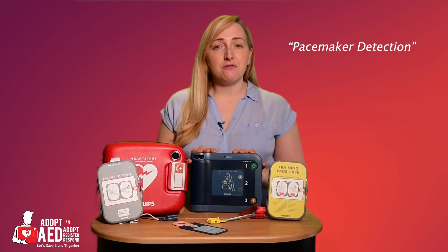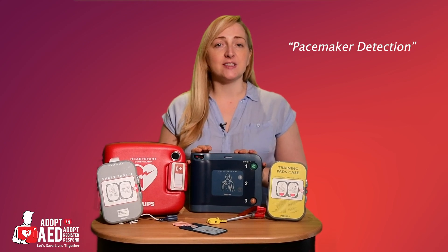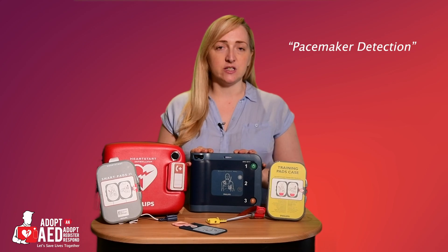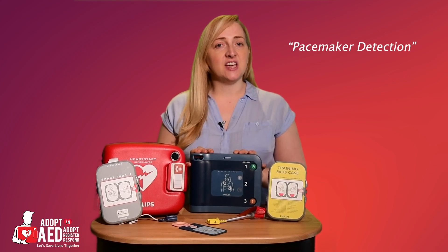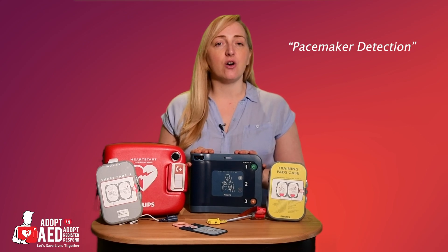The FRX also delivers biphasic therapy. This means the AED can adjust the shock therapy and delivery to each and every patient. Everyone is different and this AED is designed to analyse the requirements and adjust the shock delivery automatically.